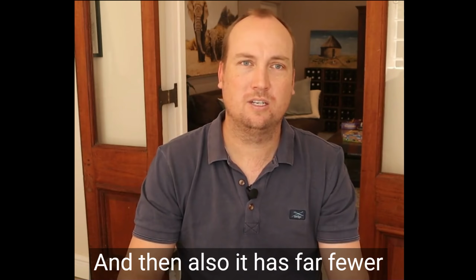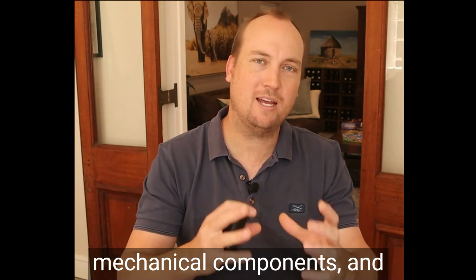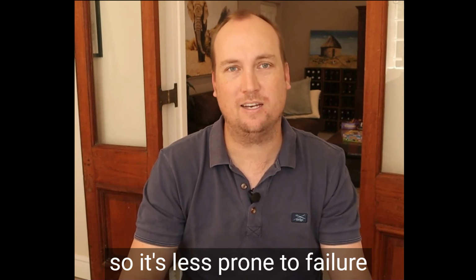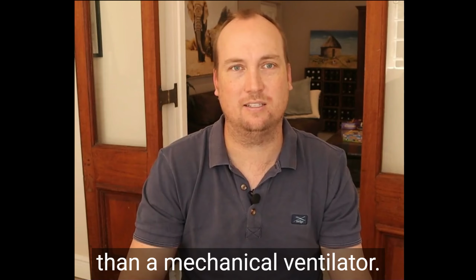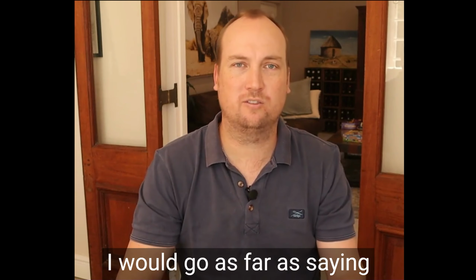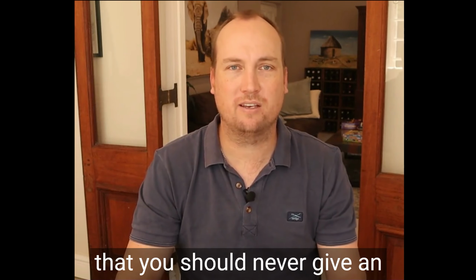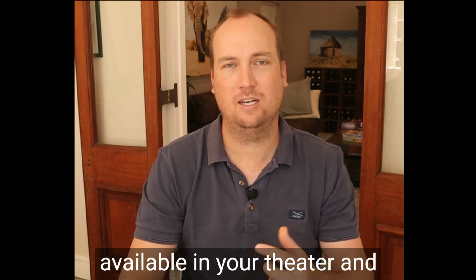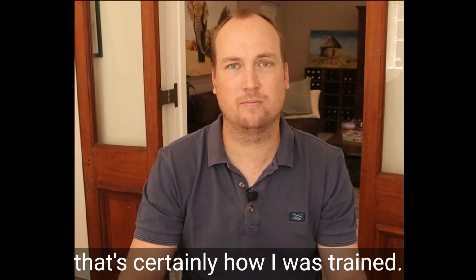And then also, it has far fewer mechanical components, and so it's less prone to failure than a mechanical ventilator. I think this device is so important, I would go as far as saying that you should never give an anesthetic without an ambu bag available in your theatre, and that's certainly how I was trained.